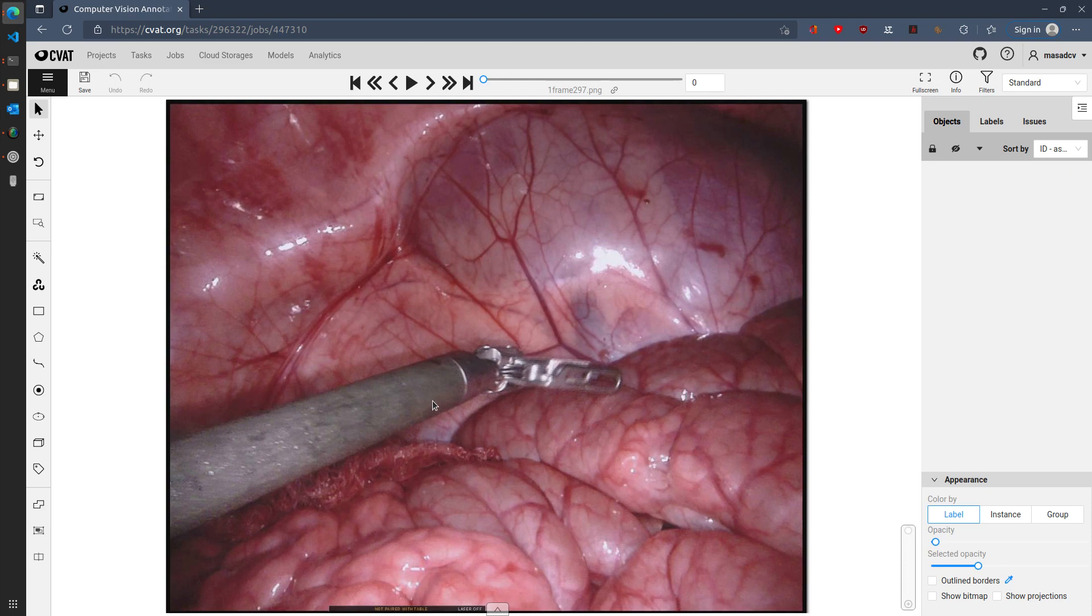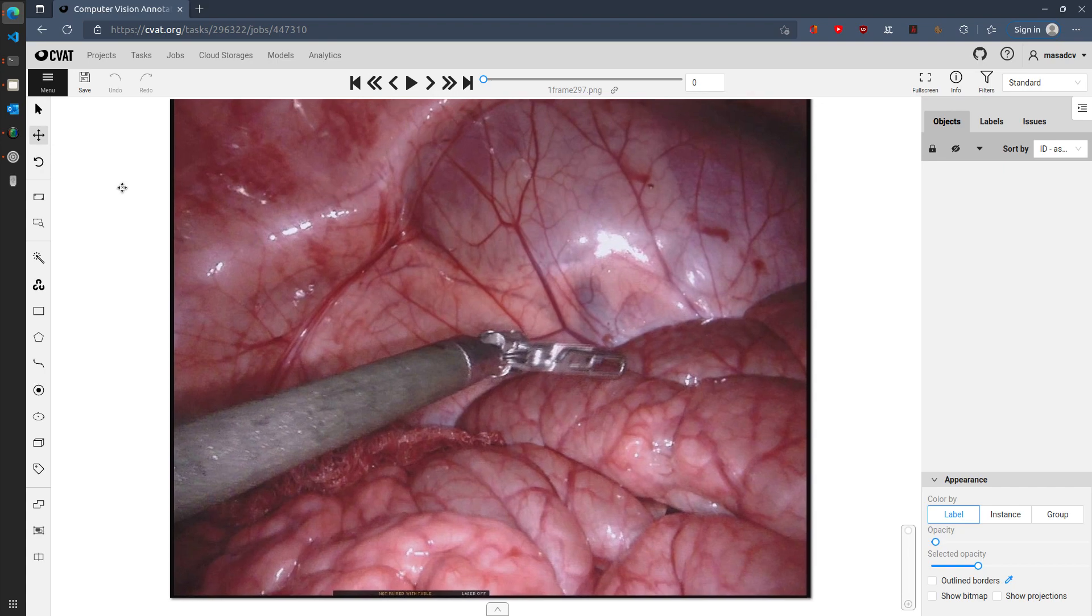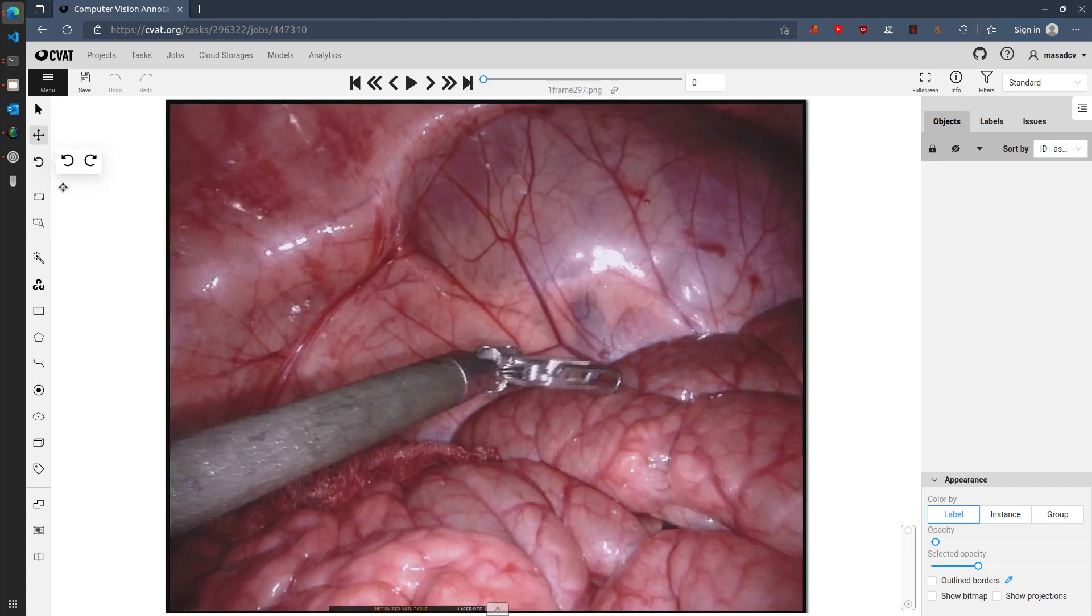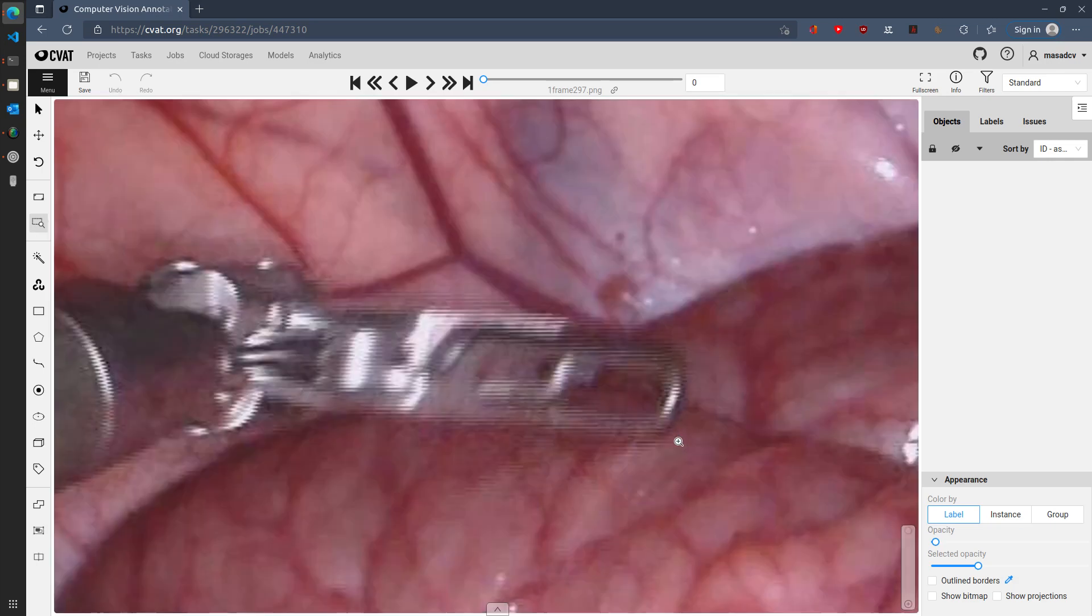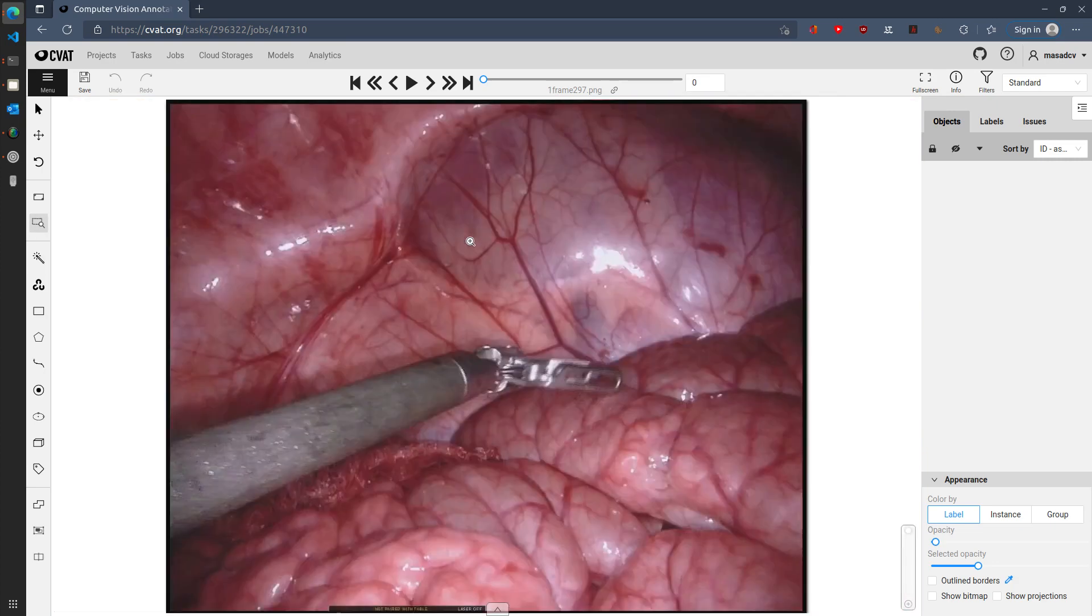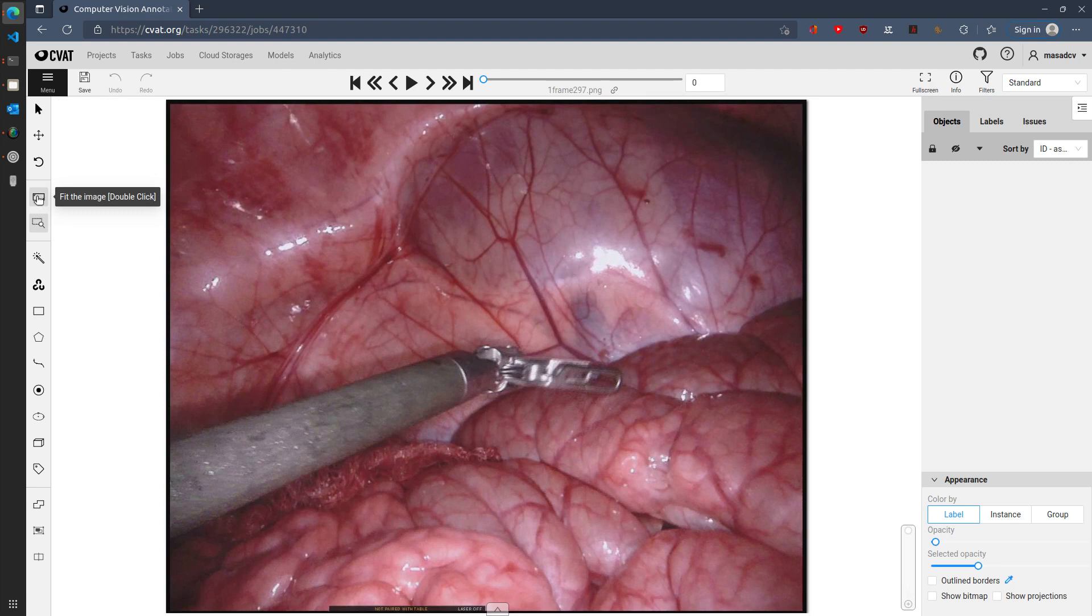So now I will explain the different tools that are shown on the left hand side for annotation. The first things shown are associated with manipulating the image for a different view. So for example, you can move the image, you can rotate it. You can also zoom into different parts of the image to provide more fine grained annotations. Once you're done, you can either double click to zoom out or click on this fit to image to fit the image to the screen.